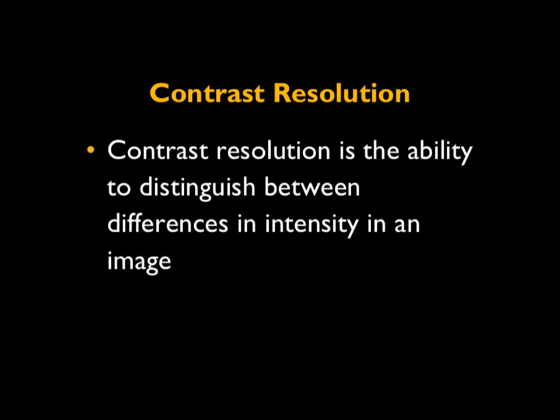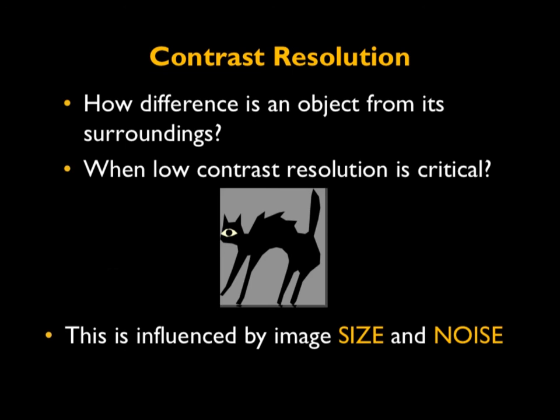The second image quality factor is the contrast resolution. Contrast resolution is defined as follows. It is the ability to distinguish between differences in intensity in an image. So how different an object is from its surroundings defines the contrast resolution.